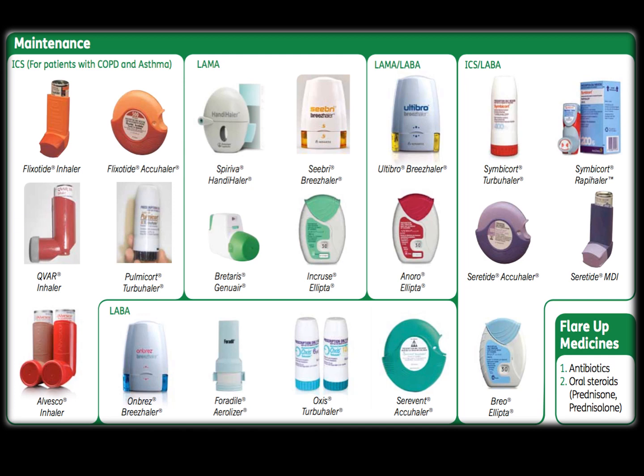What we do have in our country that are easily purchased in the pharmacy would include your Spiriva Handihaler, your Ellipta, your Onbrez Breezhaler, your Ultibro Breezhaler, Symbicort Turbuhaler, Seretide Accuhaler, which in our country is marketed as Seretide Diskus. We also have Symbicort Rapihaler, and finally a Seretide MDI.